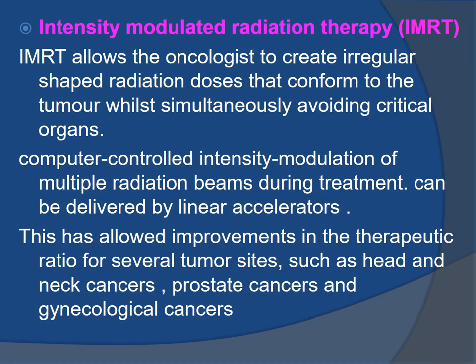gynecological cancer. In other words, intensity modulated radiotherapy is similar in technique to 3D radiotherapy. It depends on CT localization also, but it deals with the tumor as segments. It divides the tumor into segments and deals with each segment, and finally makes the doses homogeneous between these segments. So through this technique, we can deliver high doses of radiotherapy to the tumor, and at the same time decrease the radiation doses to the adjacent normal structures to the minimum.